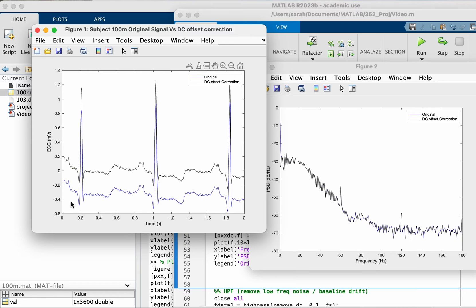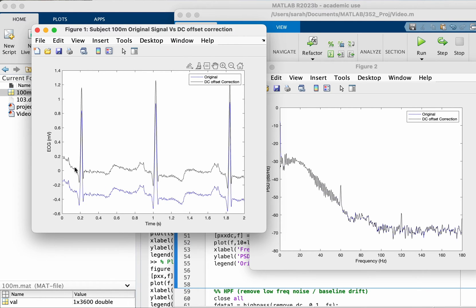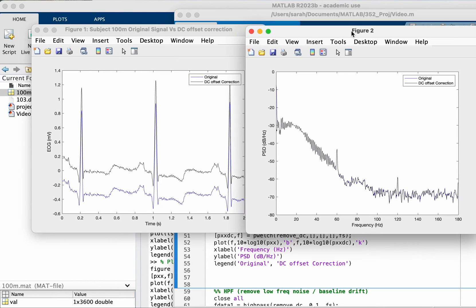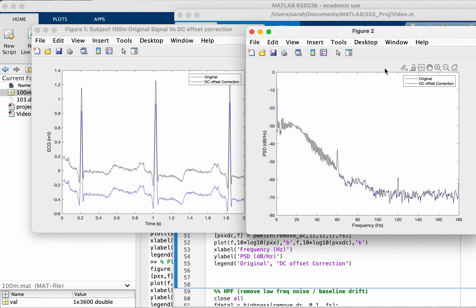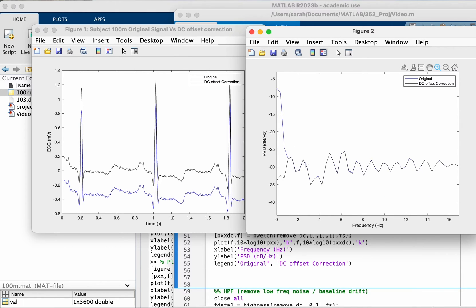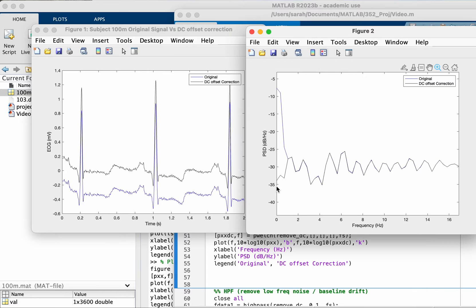You can see the original here is in blue. It is shifted down, so the DC offset is negative in this case, so we're correcting that and the signal moved up. Let's see it in the frequency domain. You can see here if you zoom in, this is the original and this is the corrected, so we removed the DC offset which happens at frequency zero.